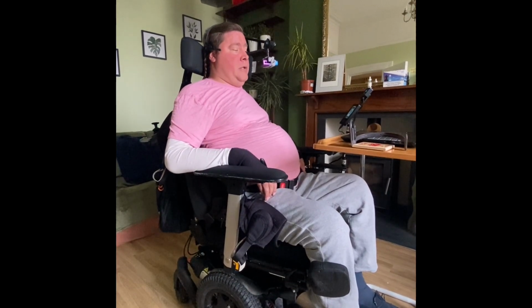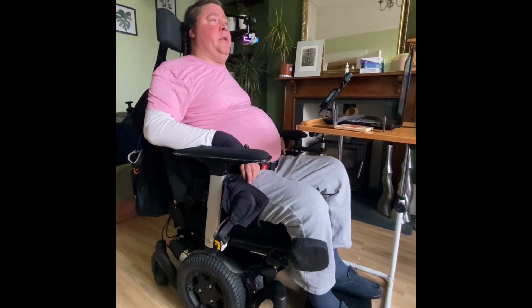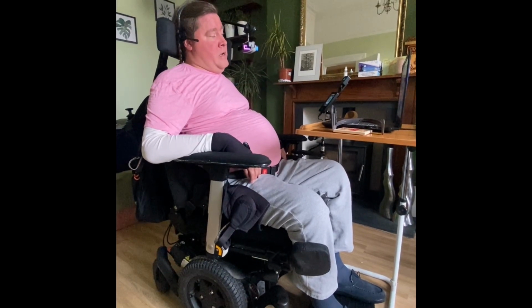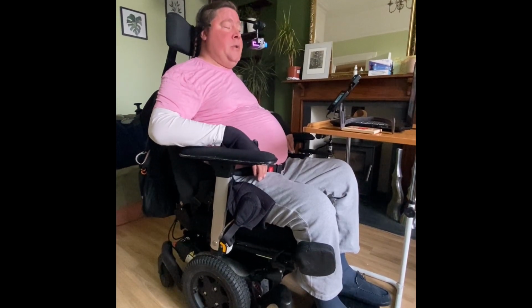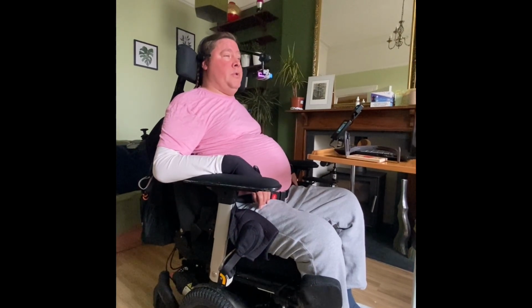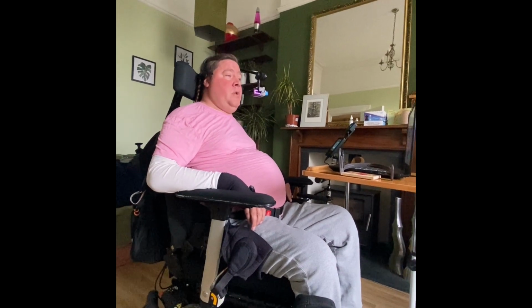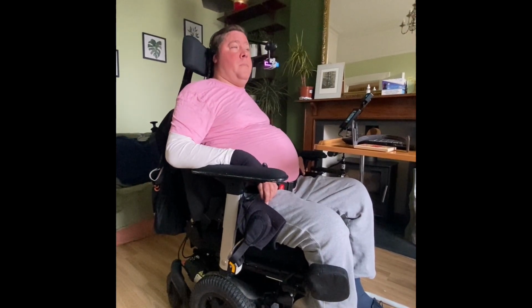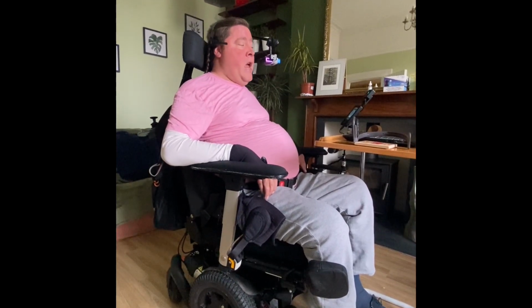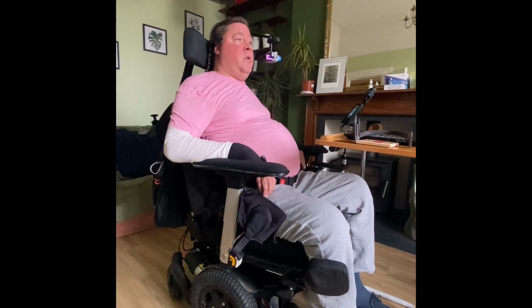During the project, I had maybe what you could call an epiphany while researching flying vehicles for able-bodied people. I came to the conclusion that why should a quadriplegic be limited to the 2D plane? Why should walls, stairs and various physical obstacles be barriers to accessing space that normal people have no problem navigating? So the project developed into an aerial mobility platform rather than a simple multimodal wheelchair that goes along the ground.